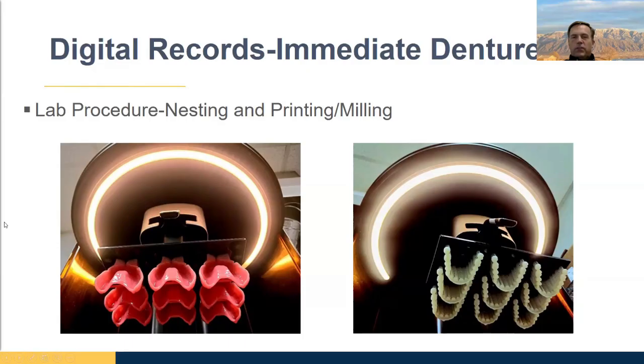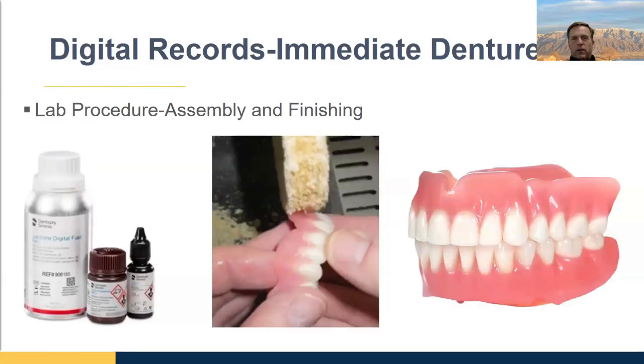So once they're printed, these little support fences have to be removed, and then the excess resin is washed off in an IPA bath usually, and then both parts of the denture are going to be post-cured. But I want to talk about that a little more in the next slide, because that's important.